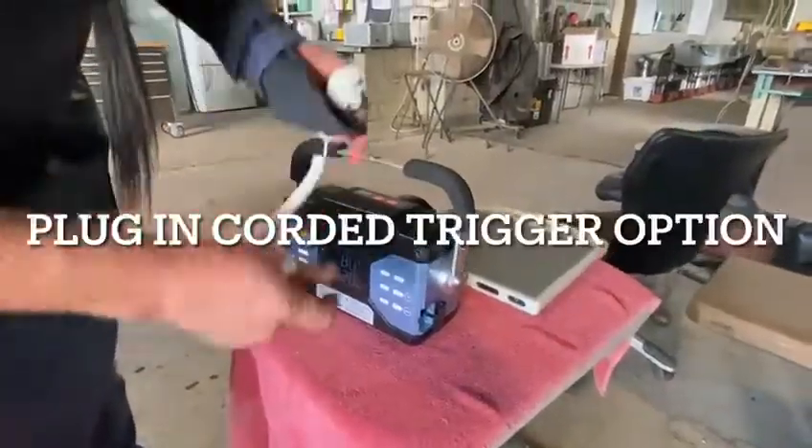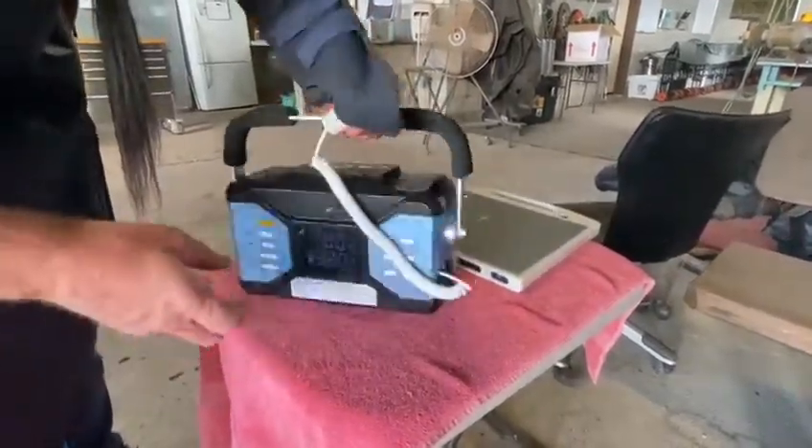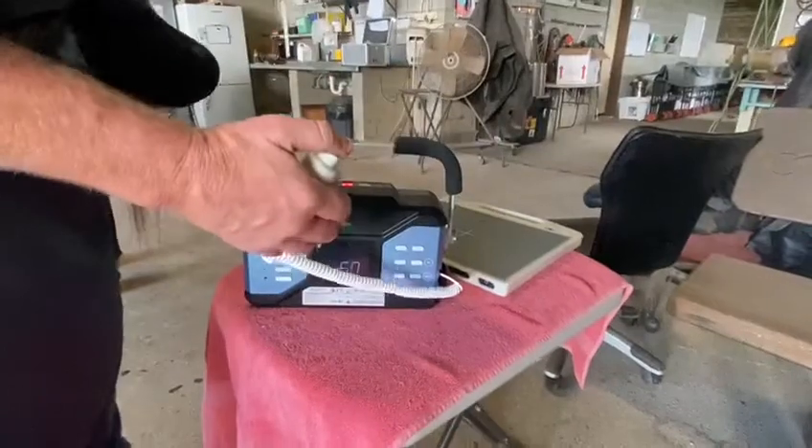You can also use the plug-in here - there's a switch here as well where you just plug it in there and it's ready to go.